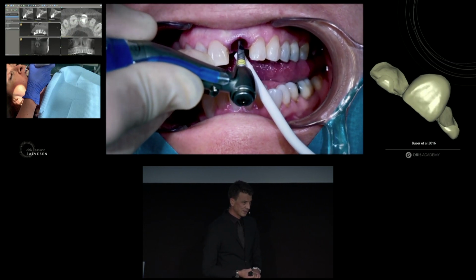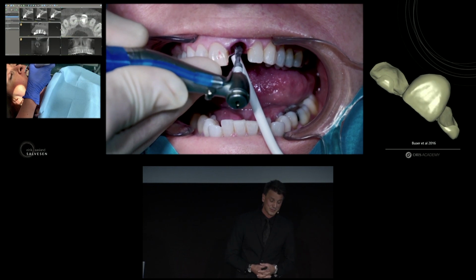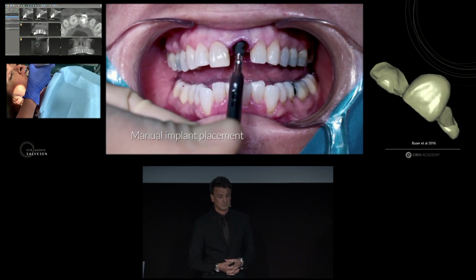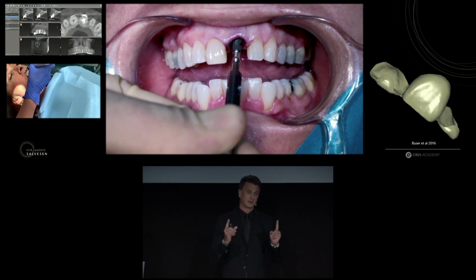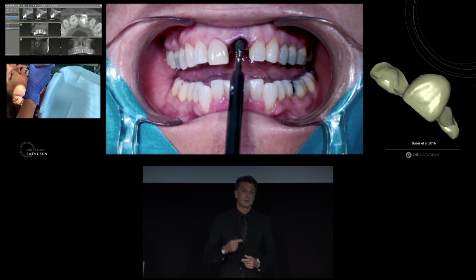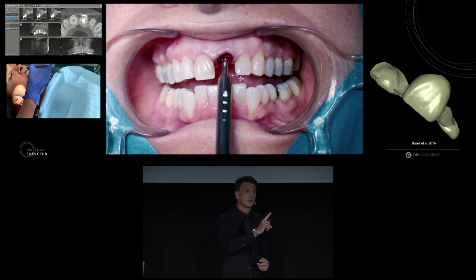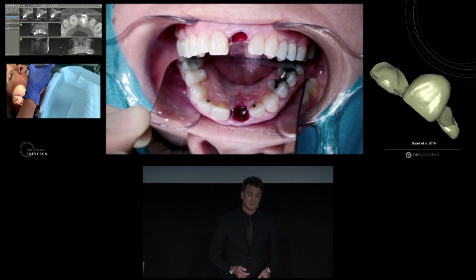And then in this case, we will finish off with the new color. If you haven't seen it, if you're a traditional Straumann user, it is a white one, 3.2. And then with a surgical screwdriver, and it's basically this big, we manually insert the implant, because we will be changing a little bit on the axis of the implant to enter the palatal bone before we angulate the implant up. The same procedure we did with the drills.